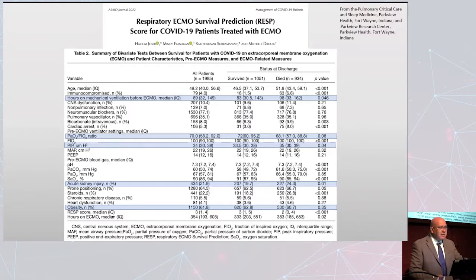So those are consistent, but there are lots of other studies out there, lots of them, that show variation from 80% survival, 50% survival, 30% survival. Our data, which we're not quite complete in putting it all together to make sure that we are as accurate as possible, but just with a caveat that this is not ready to be necessarily disseminated, Tammy, we're somewhere around 15% survival with an N of 100. So we have an N of 100 and we had about a 15% survival.